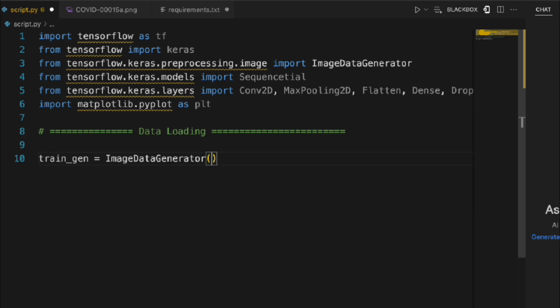So what does this actually do? It helps the neural network to learn better. It just helps make the bigger stuff smaller so it can understand what's going on. So that's going to be the first argument here. I'm going to set rescale, and I'm going to put that to be 1/255. All right, so it's just going to rescale that.